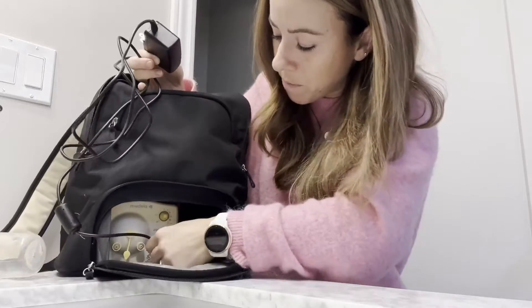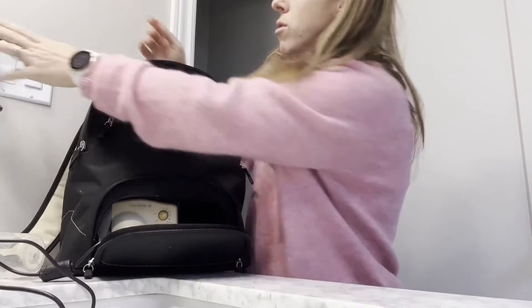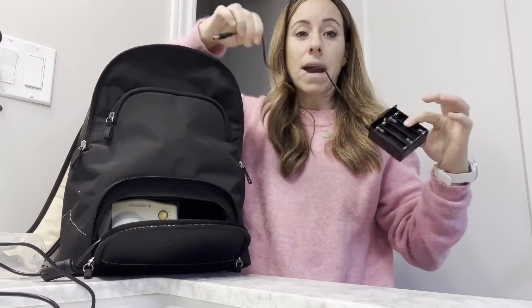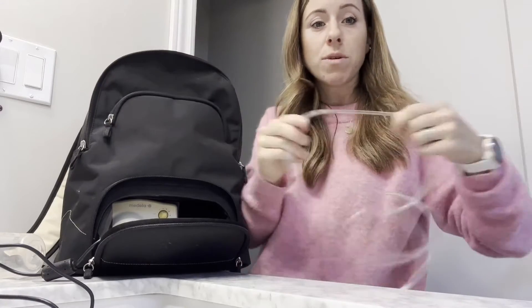This comes with something that plugs in — you literally just plug it in over here and then into an outlet. But if you're on the go and don't have an outlet, it actually comes with a battery pack as well that you just plug in and stick batteries into.